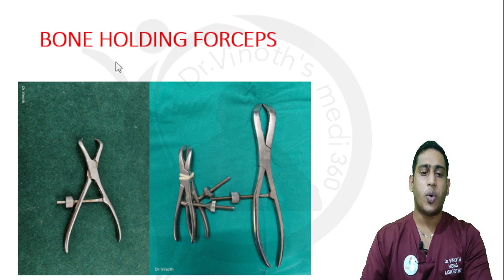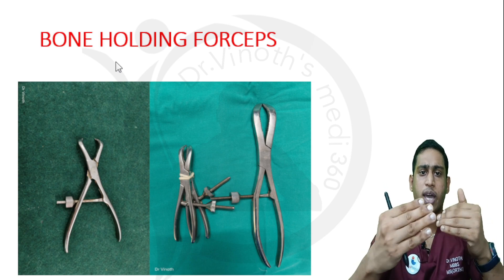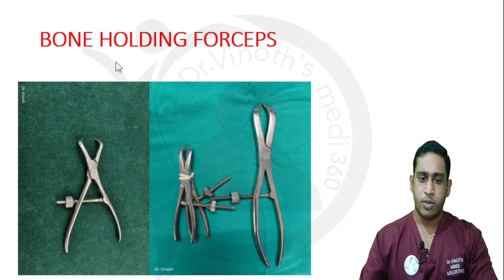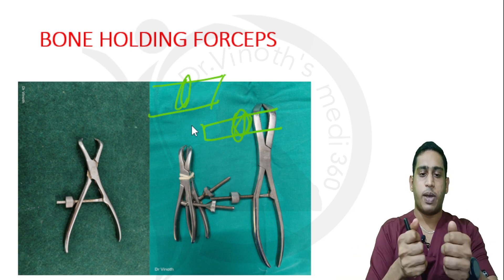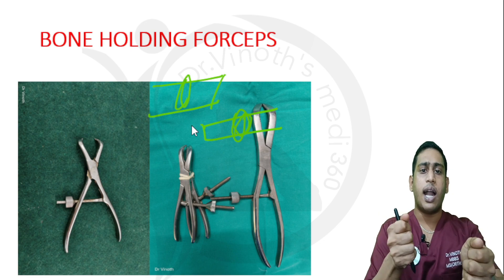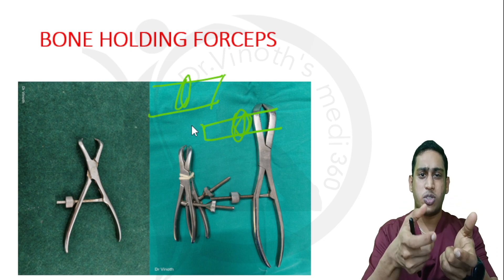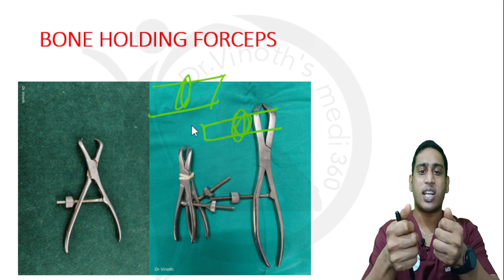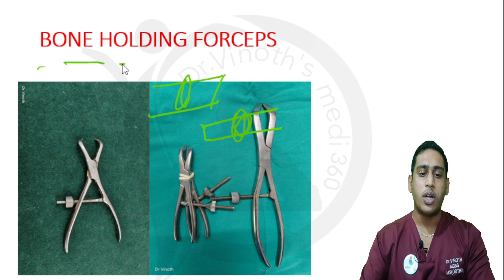The next instrument is the bone holding forceps. Whenever the fracture fragments are displaced with a huge overlap, I apply this clamp on both the proximal and distal aspects, then distract and align them. This instrument is used to hold the fracture fragments and align them intraoperatively. That is why they are called bone holding forceps.